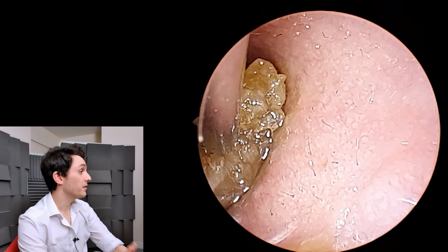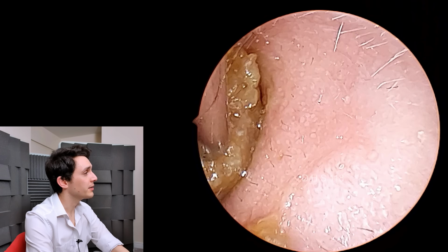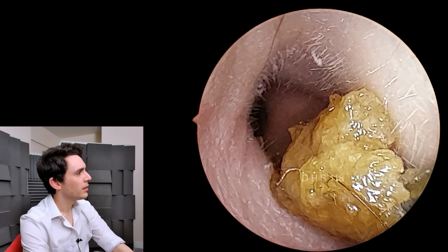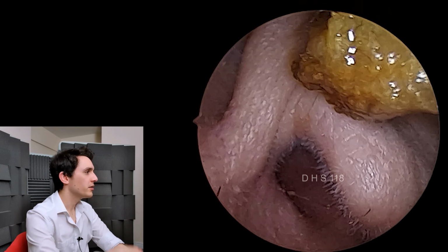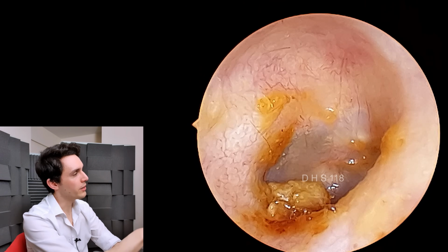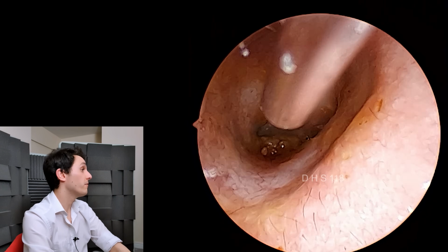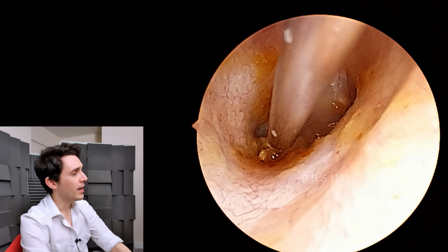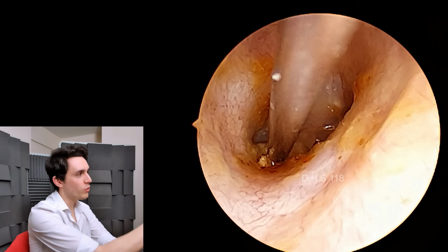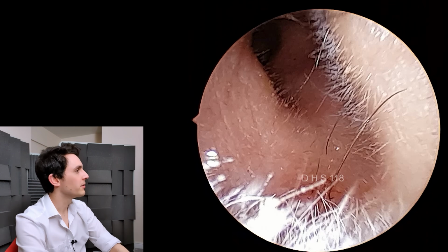It turns out to be a fairly easy case. Softish wax here, and the olive oil has lubricated the ear canal nicely. There is a little bit of wax stuck in the inferior recess. And again, we're just going to go in. You would either irrigate that with water, or you would just go in with a fine end like I'm doing here. And like most wax that's trapped in the recess, there's always more than what you think. So it's kind of an iceberg situation here. There we go. So easy stuff.